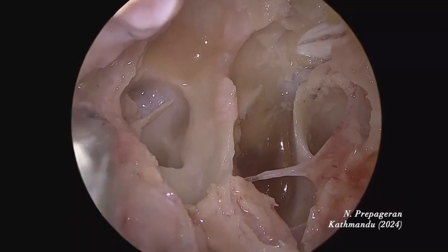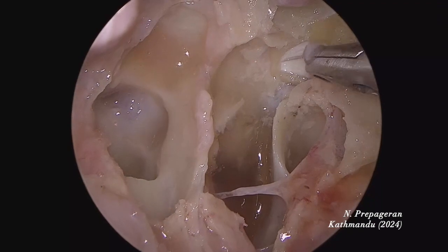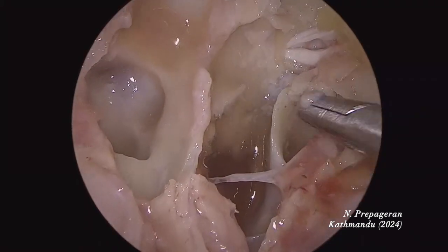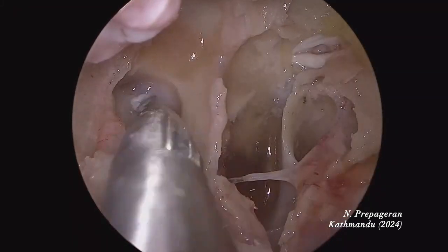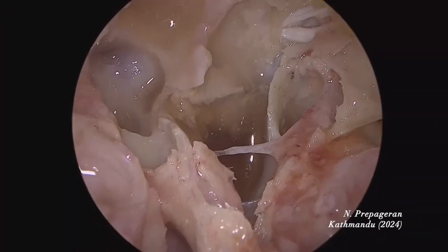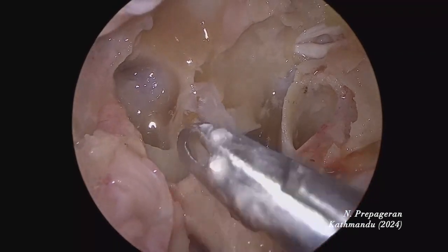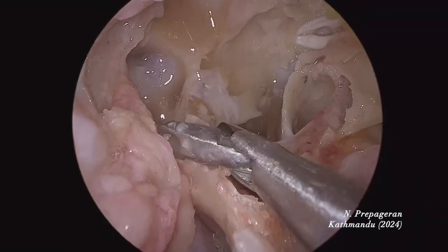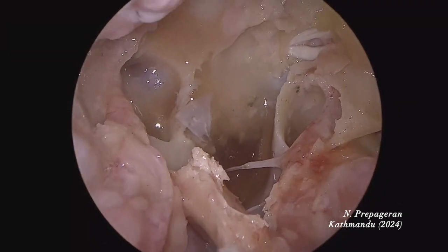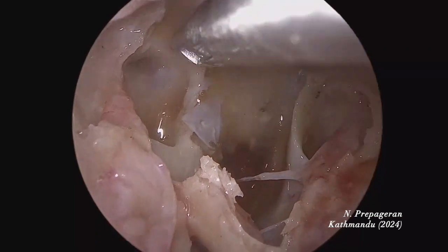This is a more difficult anatomy, which is good — yours will be much easier by comparison. The landmarks: optic nerve here, another optic nerve under the bone, carotid artery, carotid artery. There's a big septa in the midline and a septa here. I need to remove all the septas so we can have normal anatomy in the sphenoid sinus. Make your enemies your friend — your enemies are the carotid artery and the optic nerve. Those are your landmarks.